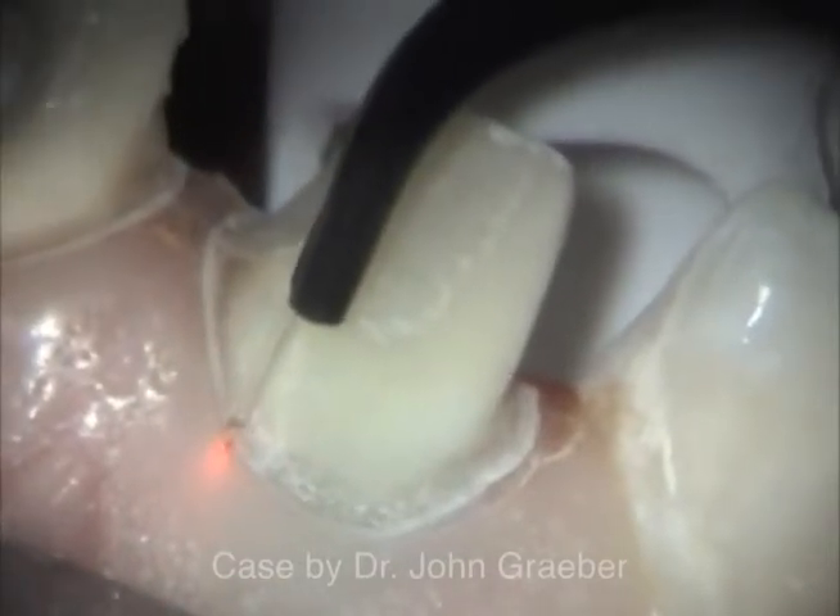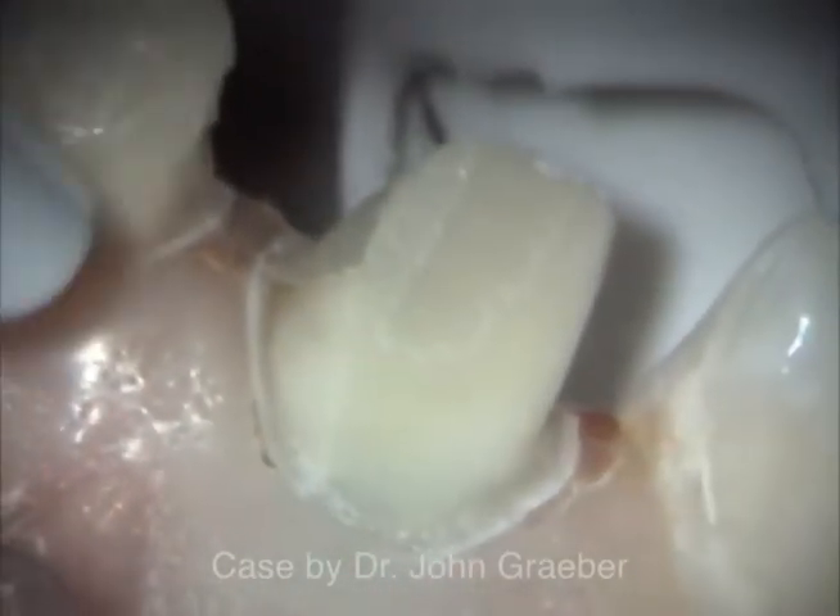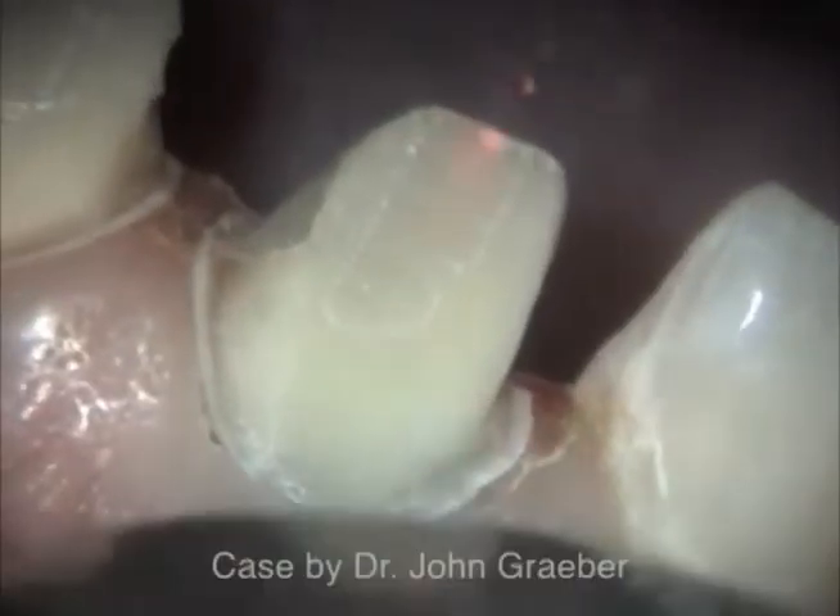At this power level, the laser will vaporize about 200 microns of tissue depth for each pass when it is held in contact.